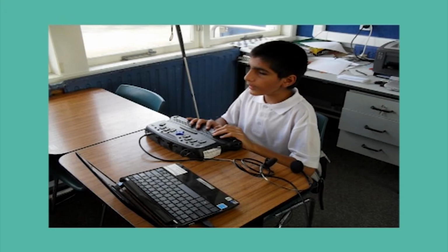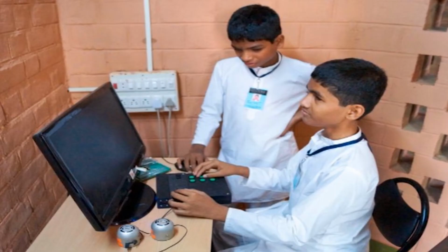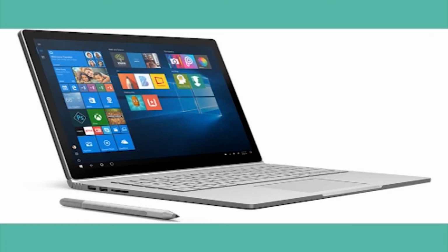Now let us see about the Braille note takers. The Braille note takers are personal digital assistants for individuals who are blind or visually impaired. Input is through a Perkins-style Braille keyboard or a standard QWERTY keyboard. It can be used by the students to take notes in the class using Braille. Those notes may be transferred to a computer for storage or for print format.